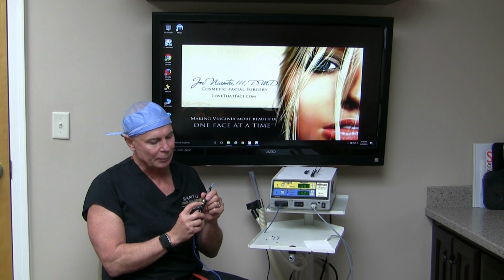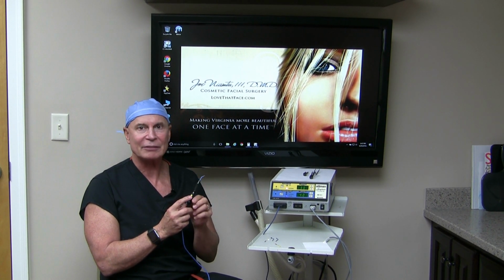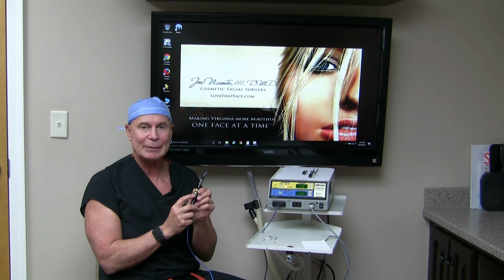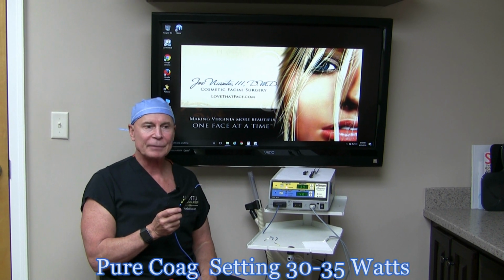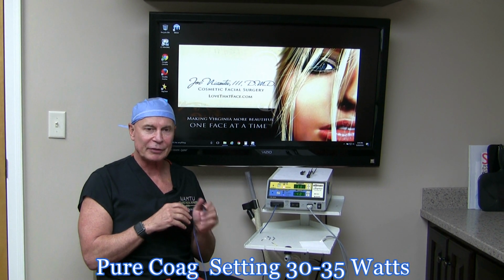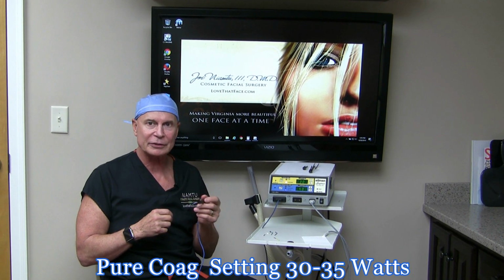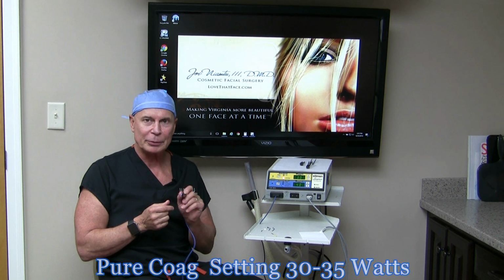The second button is for blended, that's the cut coag. I really don't use that much at all. The third button I do use, and that's hemo. So that's at about 35, and that is a setting that I will use if I really need hemostasis. So inside the mouth or on mucosa, other parts of the body, where you're not worried about a scar, I will use the pure.